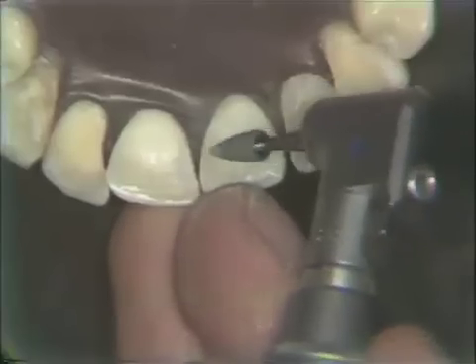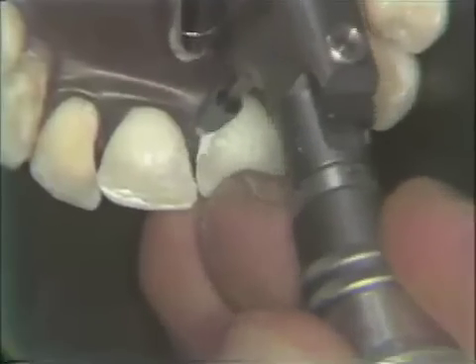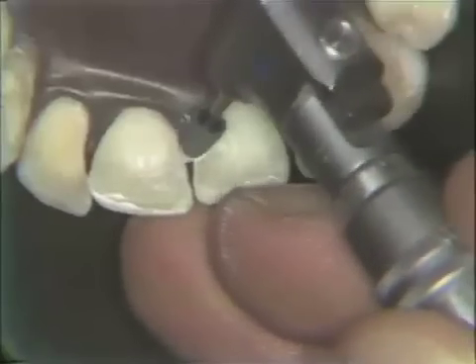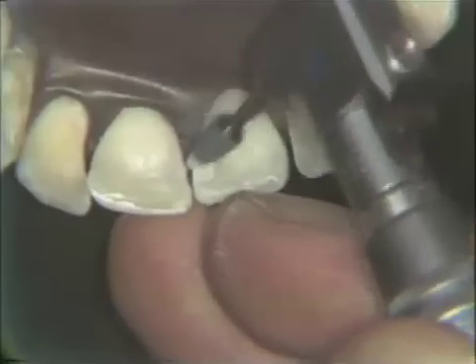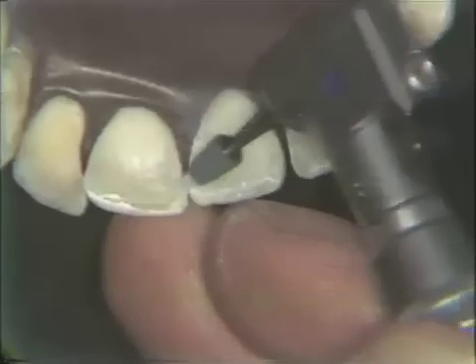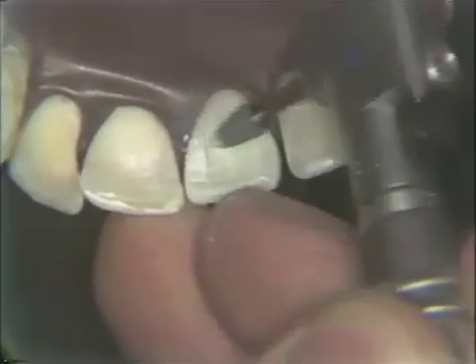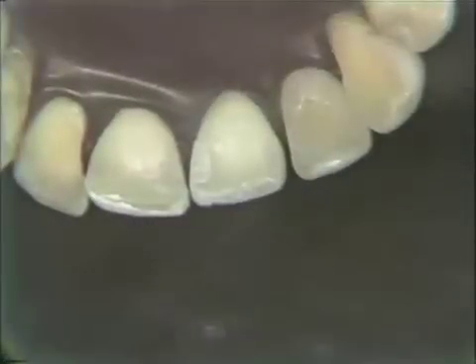Now, the carrot-shaped stone is run along the marginal ridge to develop the outer incline of the marginal ridge, and also at the cervical to take off any of the excess that we might have. It is very important in the finishing procedure to not touch the enamel, if possible. We're all going to touch it a little as we do it, but keep that to a very, very minimum, because these stones will roughen it.